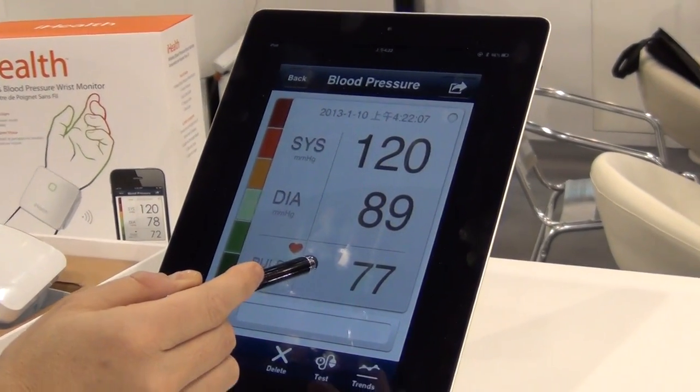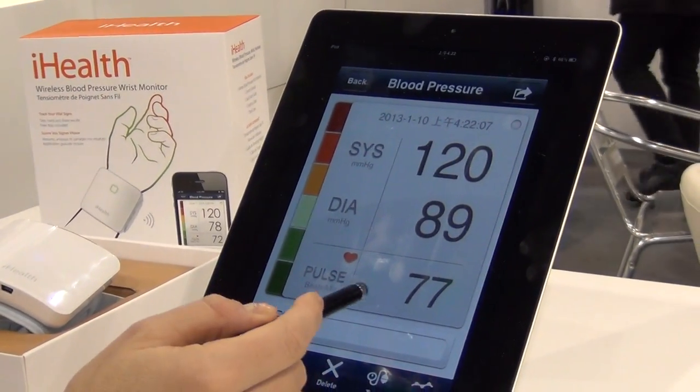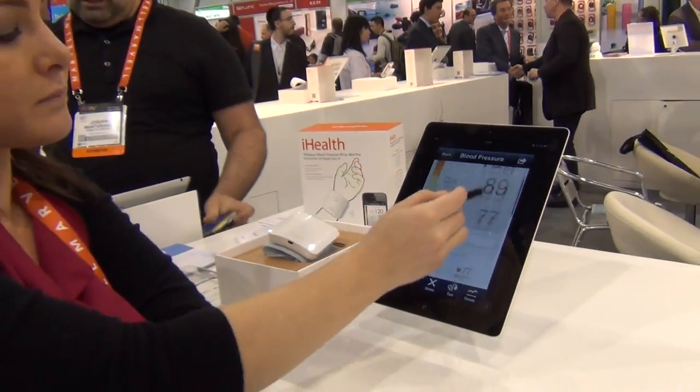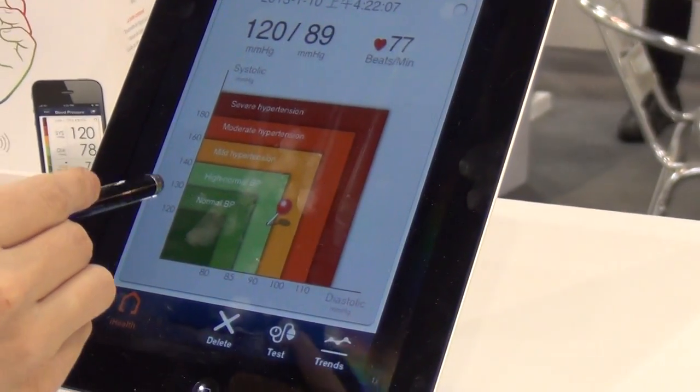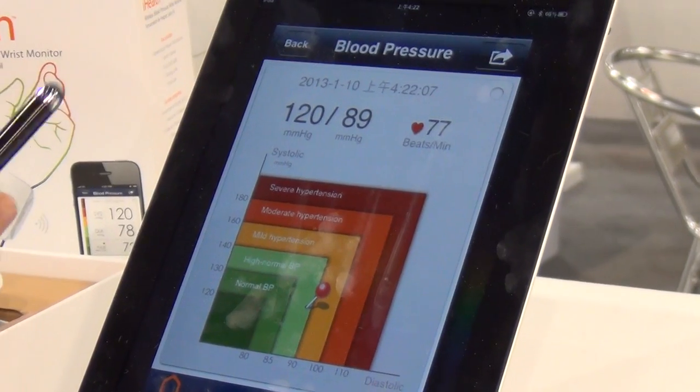You can see my results right here: 120 over 89. My pulse is at 77. And it's classifying me right here saying that I'm having high to normal blood pressure right now, which makes sense — I'm talking, I'm standing up.